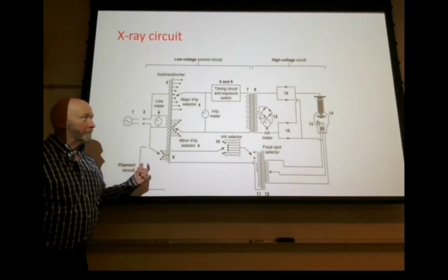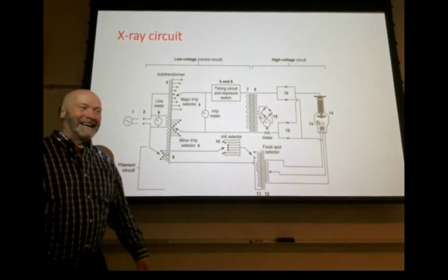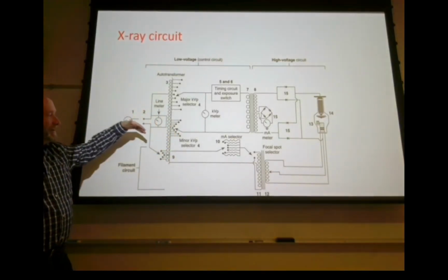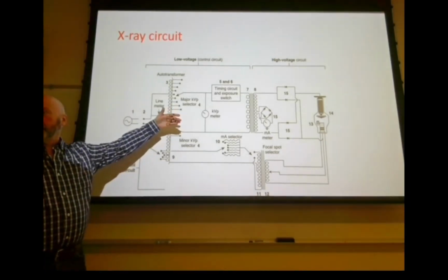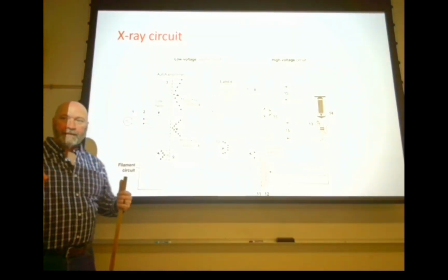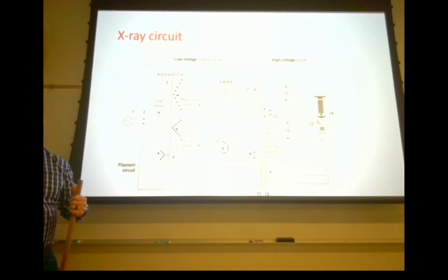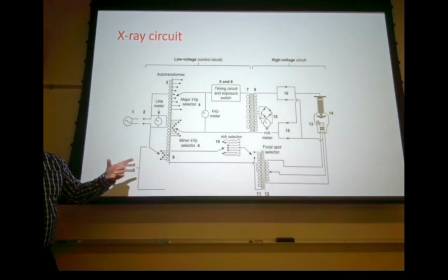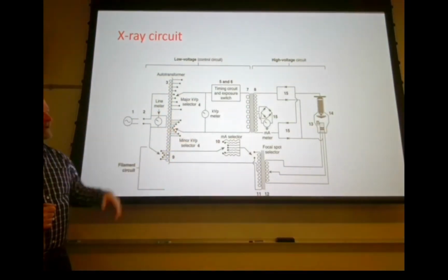So then at the auto transformer, I can't get through auto transformer. At the auto transformer, what we get is adjustment of kVp, but we don't have kVp, right? So when you're pushing those buttons and it says kVp, you know, you go from 5 kVp to 10 kVp, or you increase by 5 or 10 kVp, you're not really adjusting kVp. It'll become kVp, but at that point, it's just voltage.